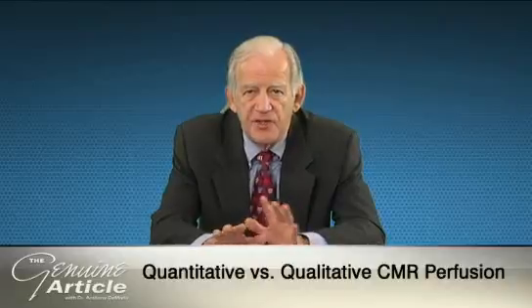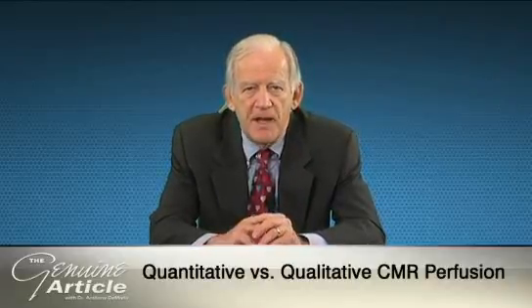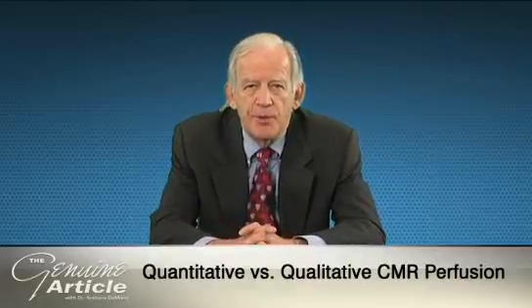Well, it's certainly an attractive concept, even if it requires a couple of gadolinium injections, to use magnetic resonance perfusion to get physiologic information and to assess ischemic burden and distinguish balanced ischemia. So I think this may be yet another boost to magnetic resonance stress testing. Thanks very much for being with us.